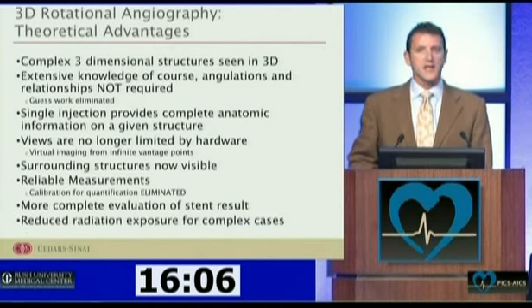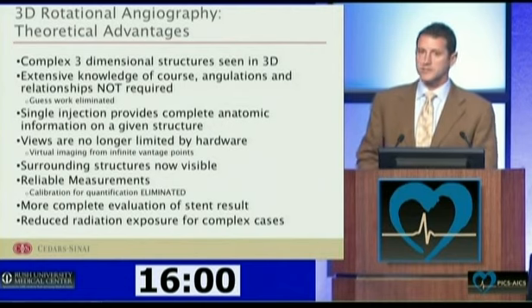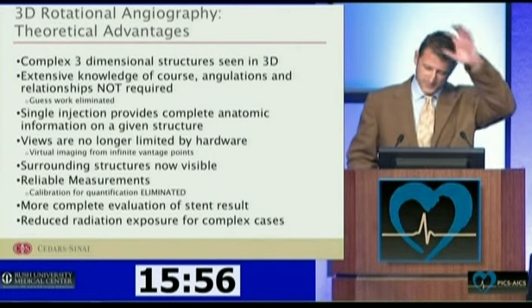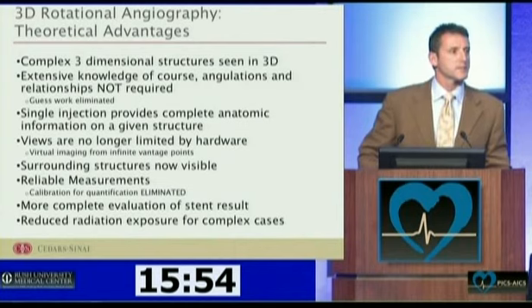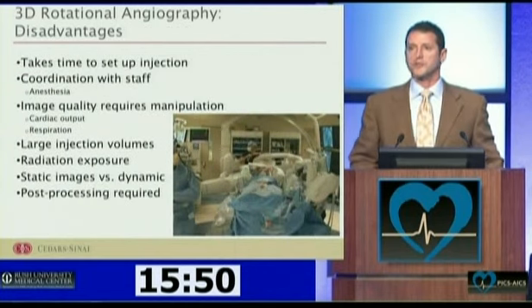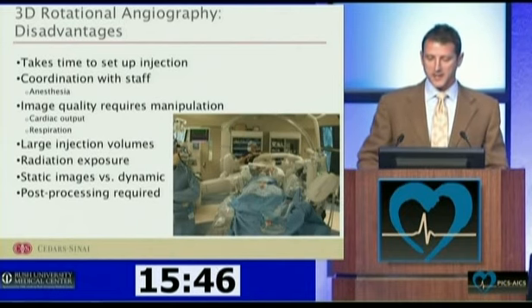And there is, as you've heard from several of the speakers tonight, at least the potential to reduce radiation exposure with these procedures, and I hope to actually show you some real-life data, limited, at the end of this presentation. But there are important disadvantages, or at least a learning curve, with 3D RA. It takes time to set it up, so as John alluded to, this is a video I like to show.